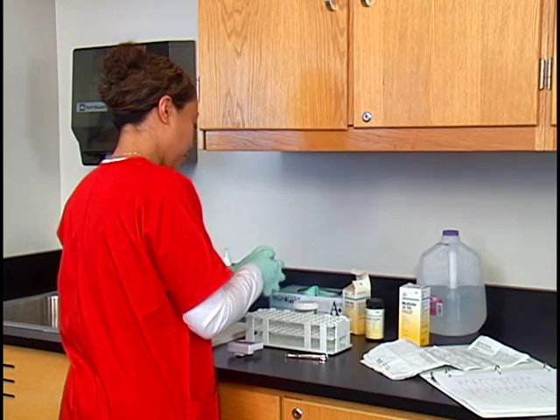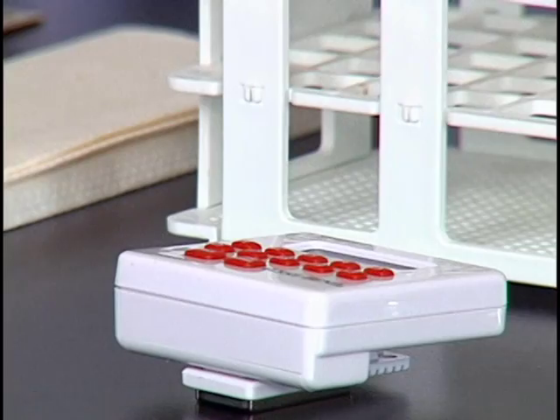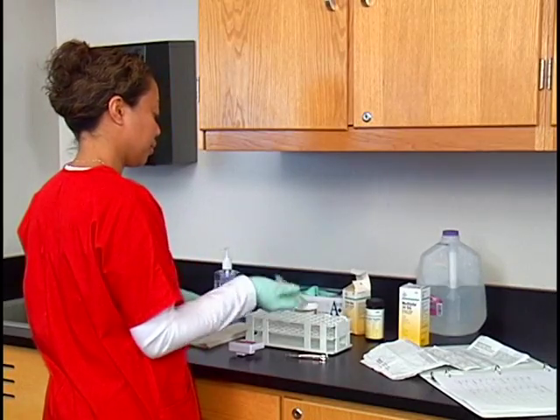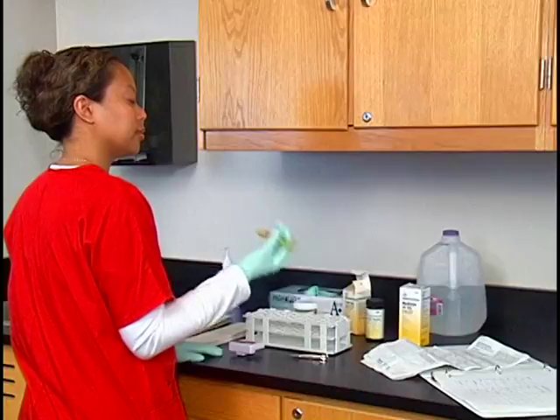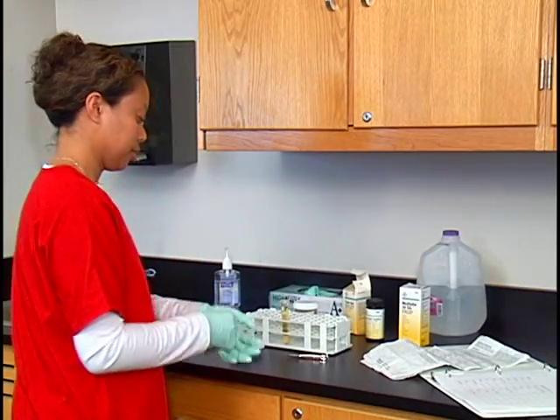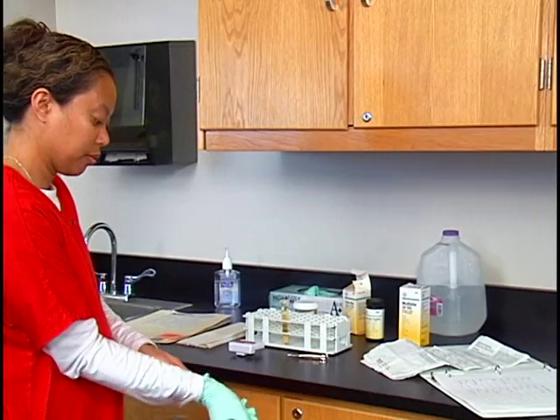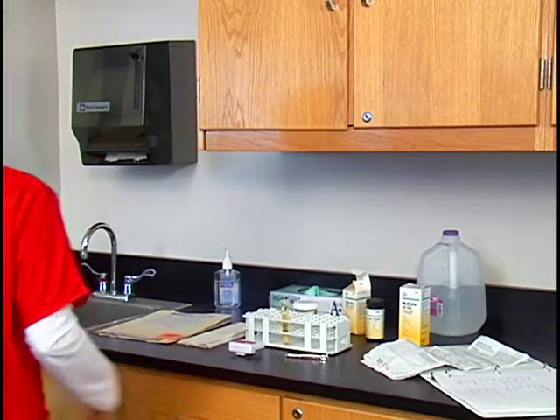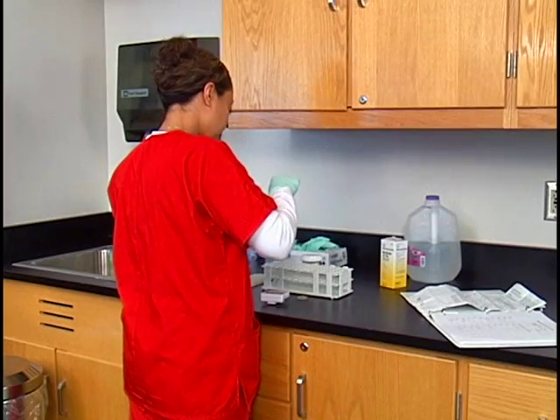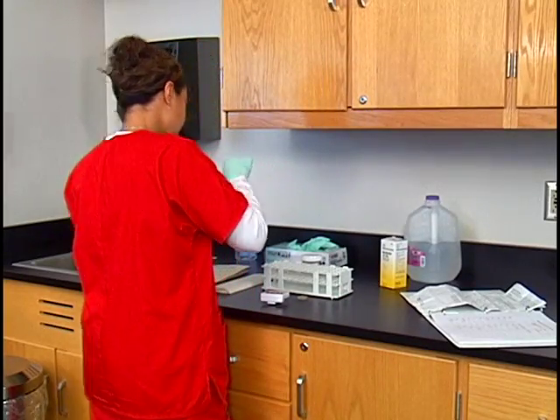Apply a cap on the tube and gently invert the tube back and forth for 2 minutes. Place the tube in a test tube rack and let it stand for 30 minutes. This allows the ingredients on the strip to dissolve in the water. Remove the strip from the tube and discard it in a waste container.